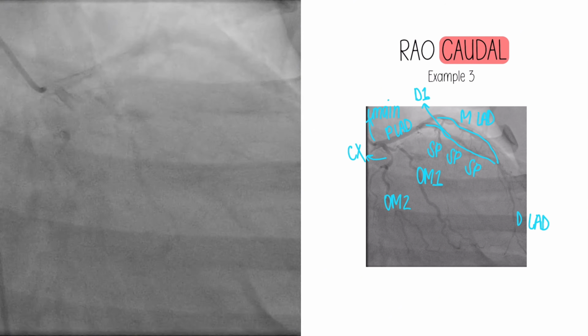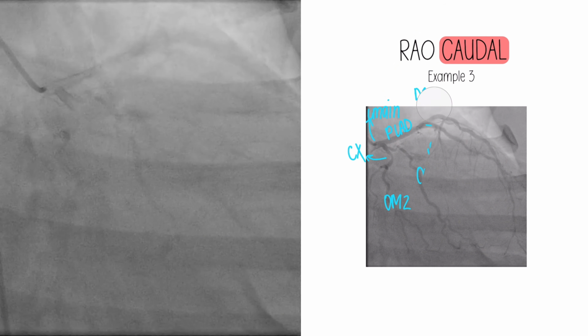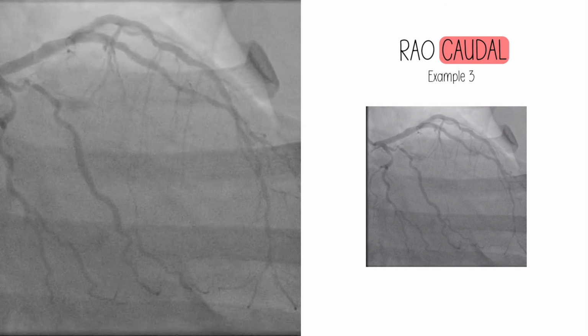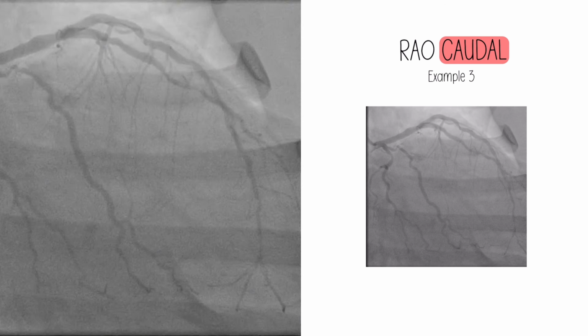And there you go. So I hope that helps. And again, as we navigate these, not one view is going to be completely perfect for every single branch that you see, and that is okay and that is normal. That's why we take multiple views.